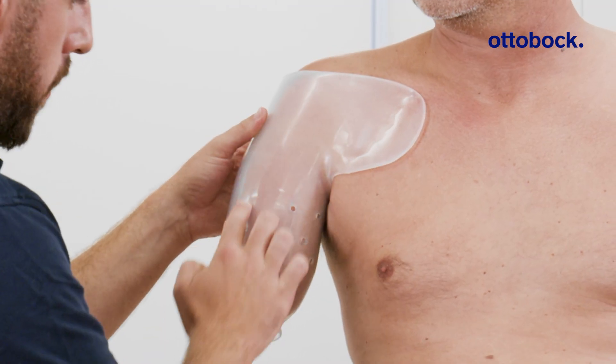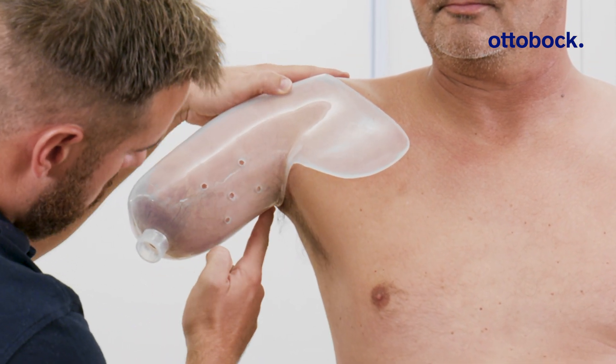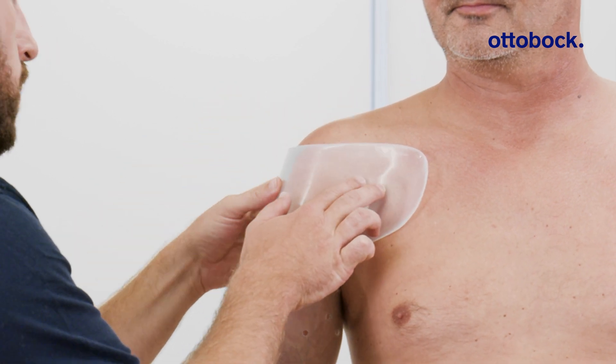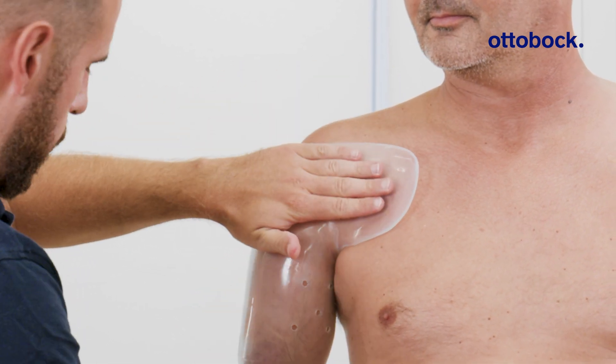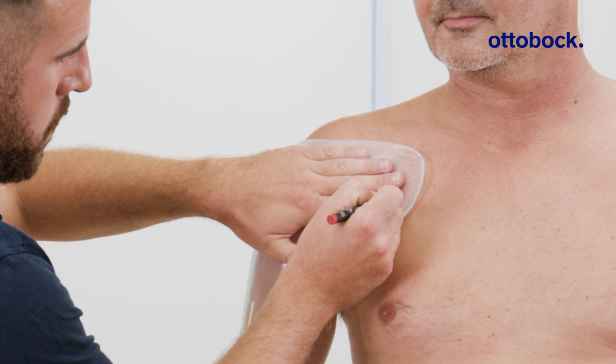Next, verify that the axillary soft tissue is fully enclosed by the socket for a secure and comfortable fit. The anterior and posterior socket walls should extend approximately one hand length from the lateral midpoint of the residual limb.